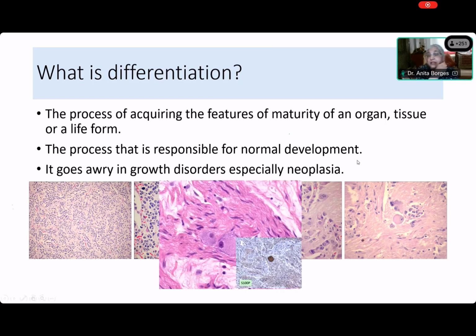All right, and see, this is the fully mature form, which is a ganglioneuroma. An S100 protein has been done on this case because the neuroma part should be Schwannian, and therefore it should express S100 protein. So this is the most differentiated part of what is happening in a tumor. Neuroblastomas do this by themselves. That means over a long period of time a neuroblastoma, if it hasn't killed the patient, will become a ganglioneuroma. This happens under differentiating principles that are present in the body. But if you start treating a patient with a neuroblastoma, sometimes you end up with a ganglioneuroma.